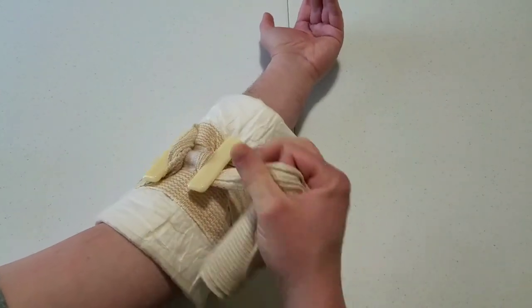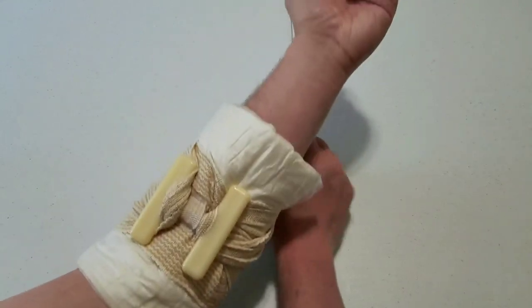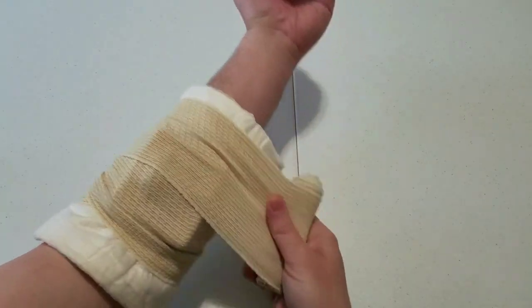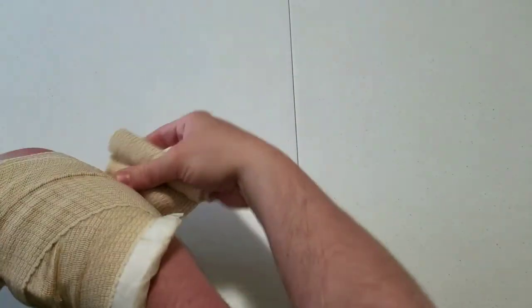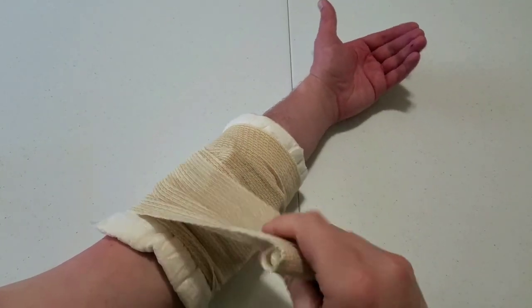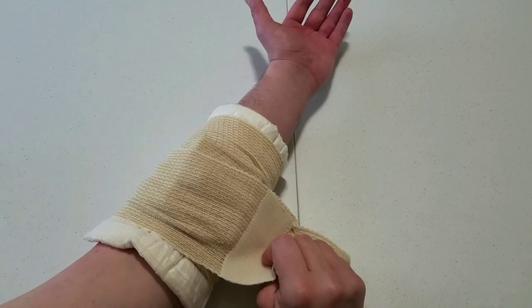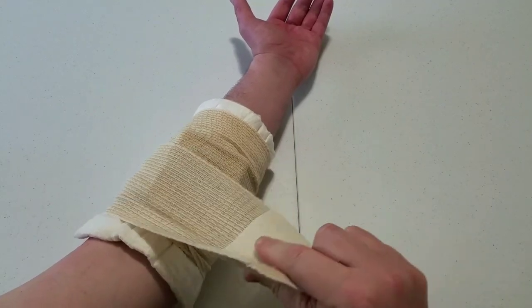Now I can pull some tension, but it wants to slide. The tighter you pull the more pressure it's going to apply. Once you've applied all the pressure you want, you start wrapping. Because this pad is so big I've got to wrap high and low back and forth to get it to cover the whole thing. However, they don't give you enough wrap to cover the whole thing — I'm already out and I haven't completely covered the top or the bottom. So while it is an 8-inch pad you're not going to get 8 inches of coverage; you might get 6 if you wrap it really well.